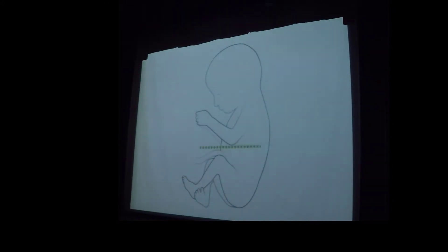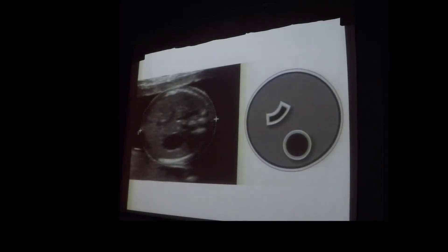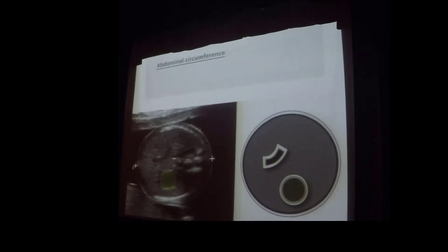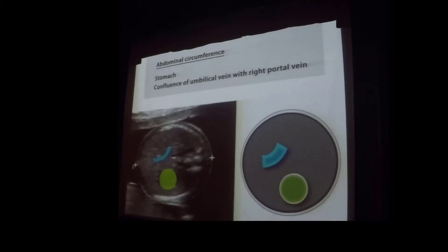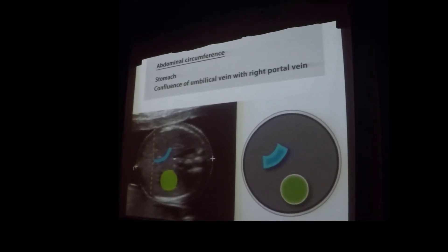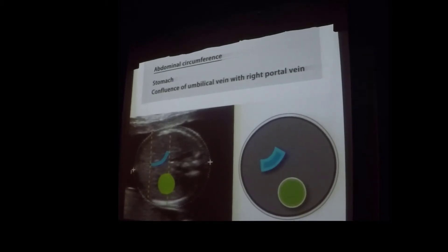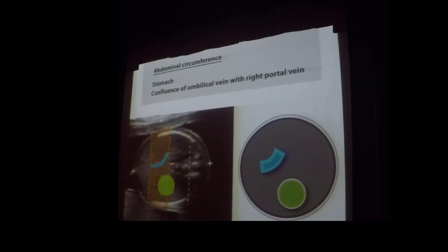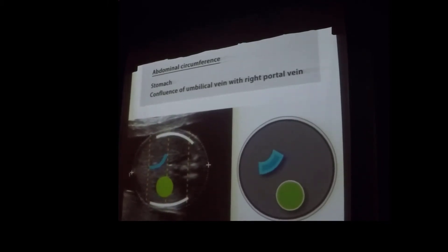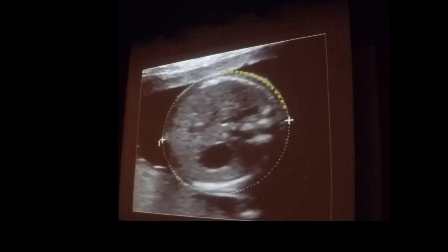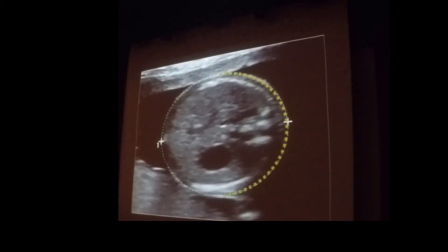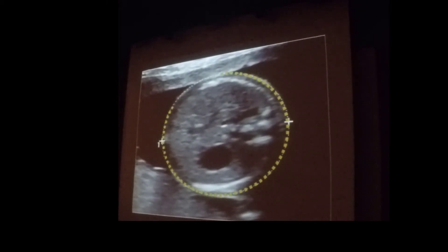The abdominal circumference is measured in a transverse plane in the mid-abdomen. Sonographically, it is measured at the level of the stomach and the confluence of the umbilical vein with the right portal vein, which appears as a J-shaped structure. If the fetal abdomen is divided into four equal sections, the umbilical vein should appear in the second portion only. Ideally, one rib is visible on each side to indicate that the image was not taken at an oblique angle. The abdominal circumference is measured by placing an ellipse around the outer border of the skin. This parameter varies more than either the head or femur measurements and is most affected by fetal growth.